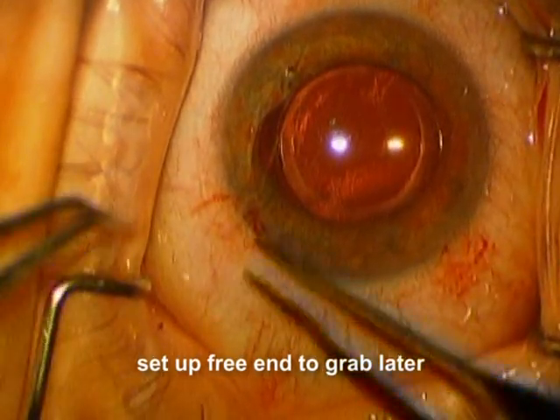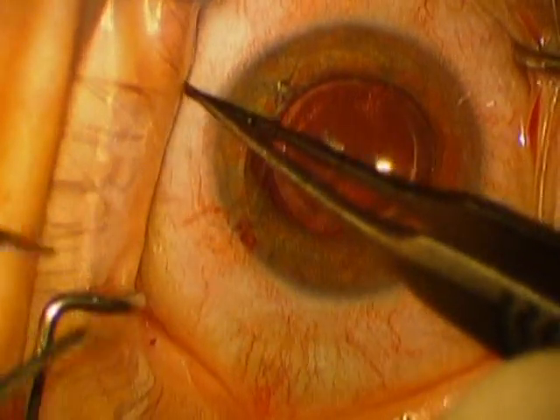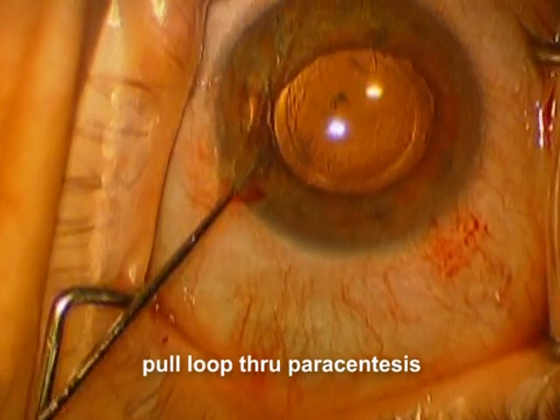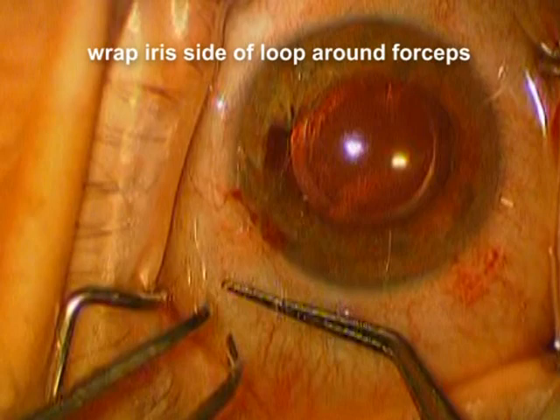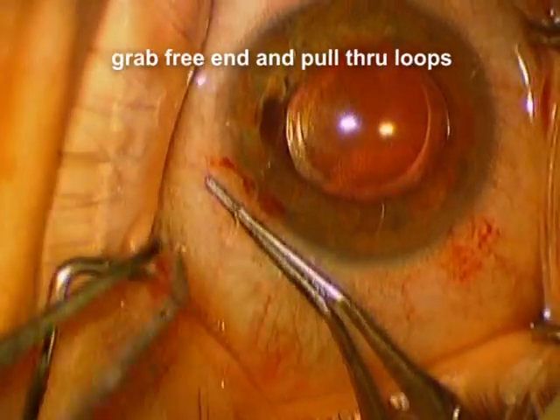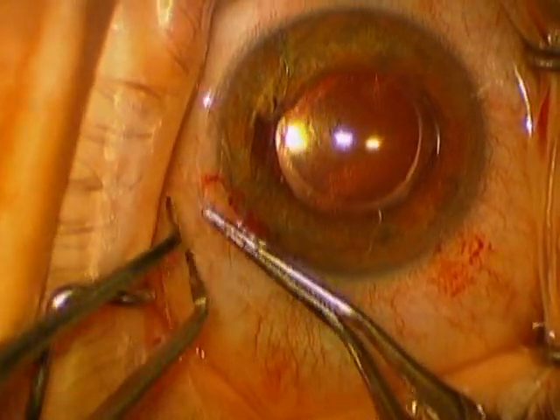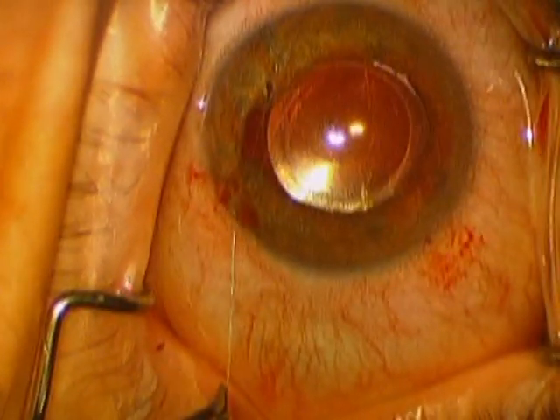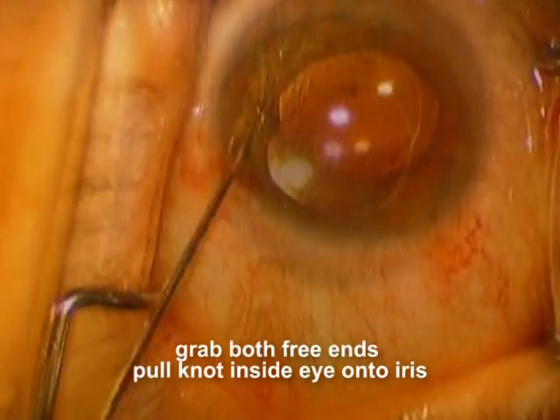So now we have a free end coming out. We're going to tee up that free end so that it's easy to grab — curling it around over there and placing the end so that we can easily grab it. Now we're going to pull the loop through from the other side using a Kuglen hook. We're going to set up the loop so we can wrap it around. We're going to wrap the iris side around three times and then grab that free end that we teed up. Now we're going to pull that free end through those three loops, pulling on one free end and pulling on the other. The knot goes inside the eye and you can see how it cinches down the iris nicely.